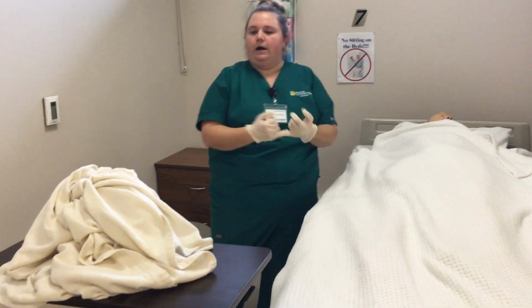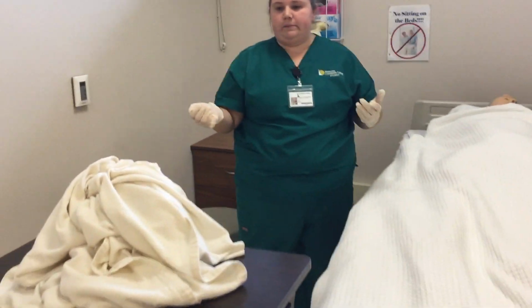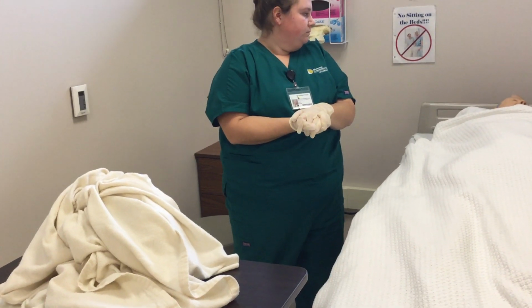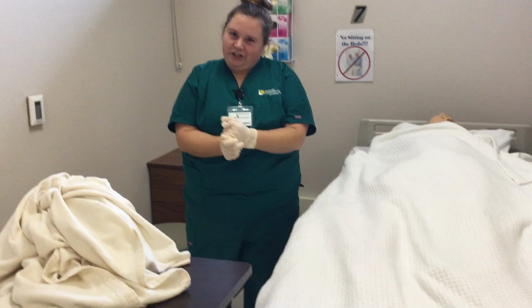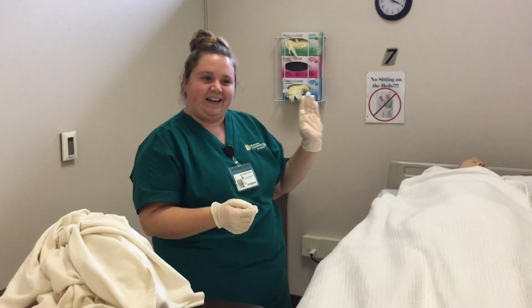Obviously I document, but I have to go and physically do the documentation when I'm done. And then I'd make sure that there was no leaking in the catheter and the tubing.